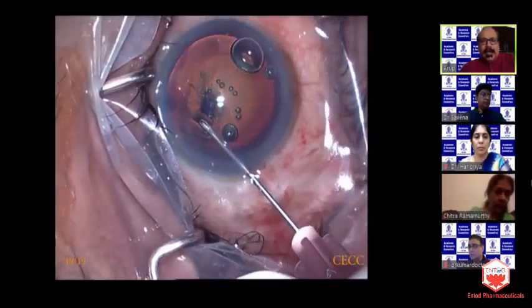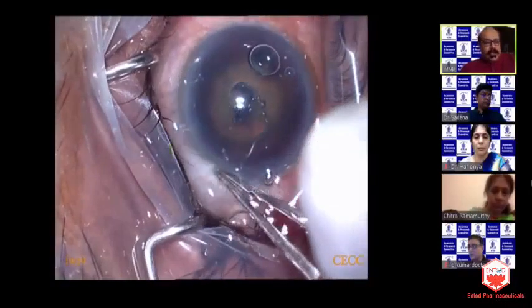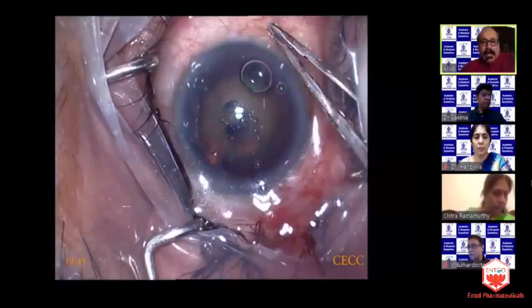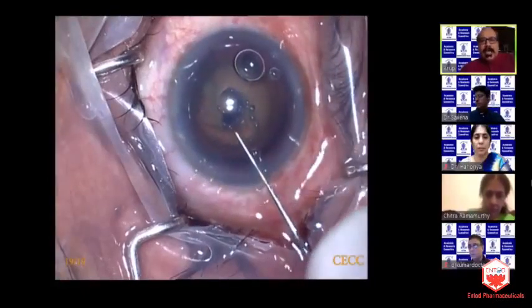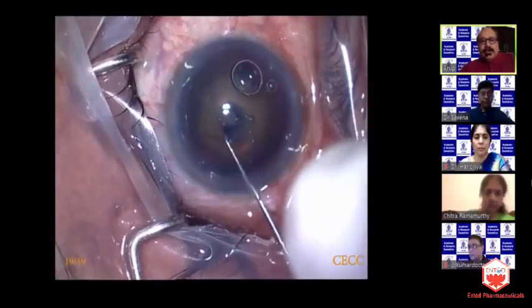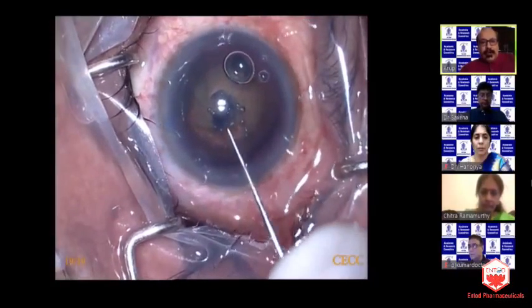I somehow managed to come out with a decent capsular rhexis, but the pressure doesn't come down. So I have to think about alternative plans. So I decided to go ahead with something that is debatable but very logical to reduce the intraocular pressure, and that is pars plana anterior vitrectomy. So I used a 23-gauge trocar cannula system to make a self-sealing sclerotomy for the vitrectomy.